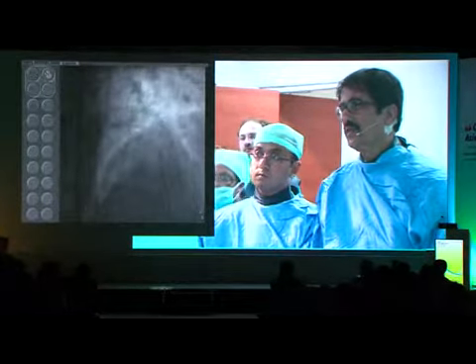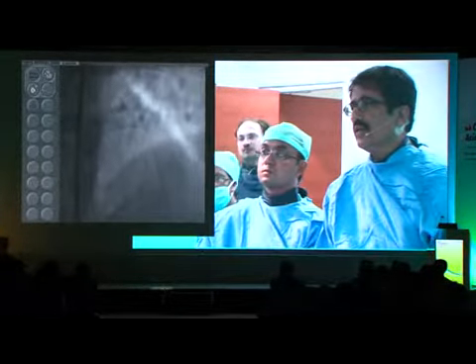Dr. Mehta, I agree with him. Because many times we do a main branch stenting and just a ballooning of the side branch. And when you do a ballooning of the side branch, part of the struts fall into the side branch. So it is not necessary that all the side branch needs to be stented, and this could even serve that purpose. They showed some of these cases at EuroPCR this year, and they were saying that it should be used where there's only minimal lesion involving the side branch. You want to just scaffold it, and there isn't much disease in the side branch. So it is ideal for Medina 111 in some cases.